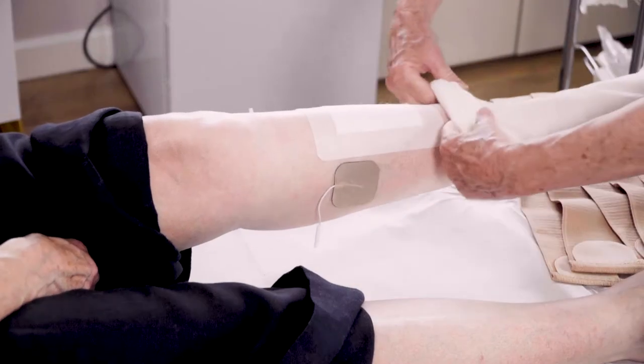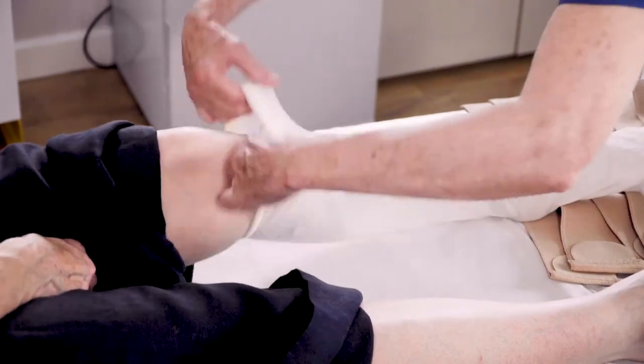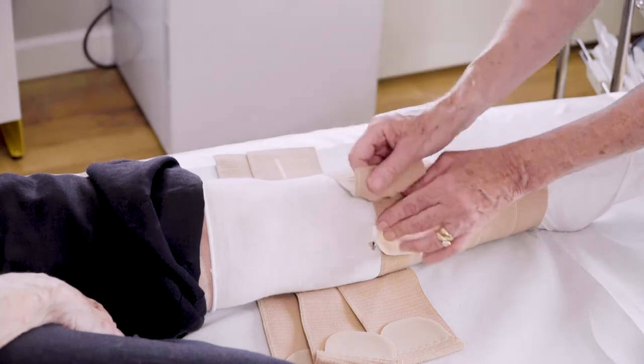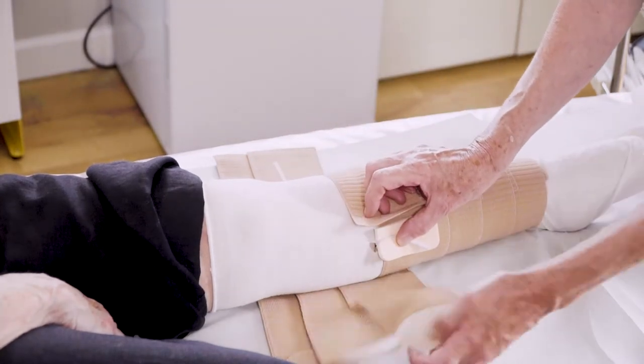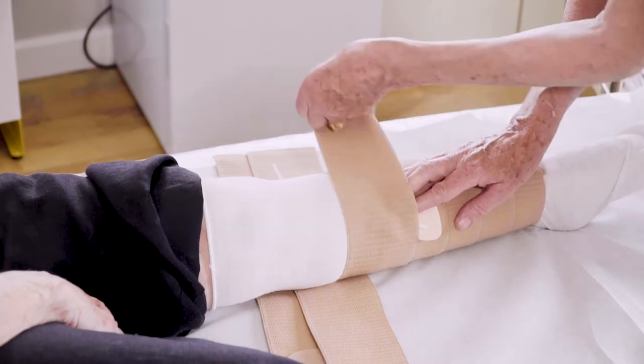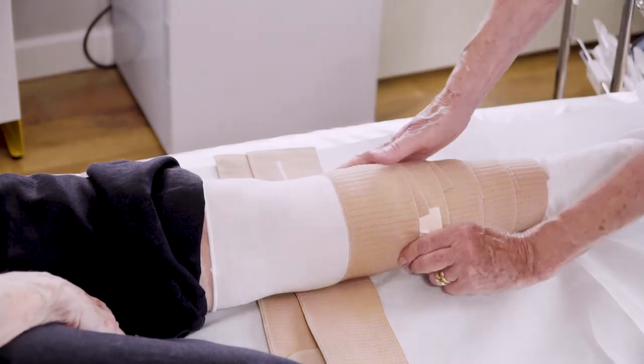You are now ready to apply the compression wrap. First, protect the area under the electrode wires with a simple foam adhesive dressing to avoid any pressure injuries, then follow the manufacturer instructions for applying the wrap and feed the wire between the overlap straps.